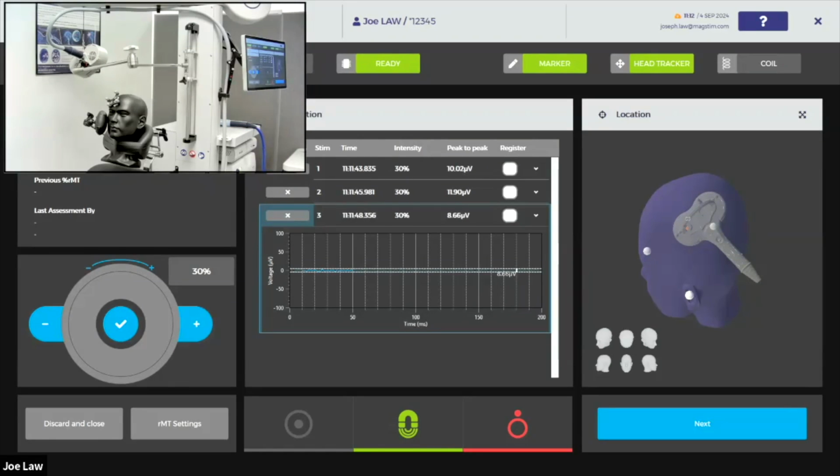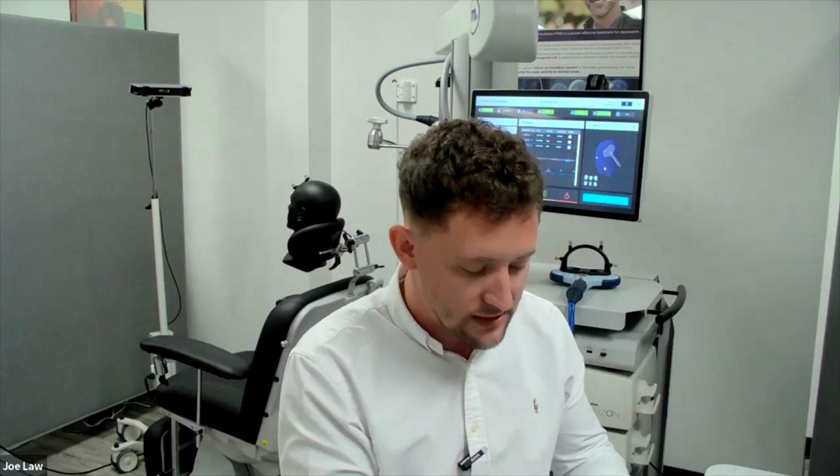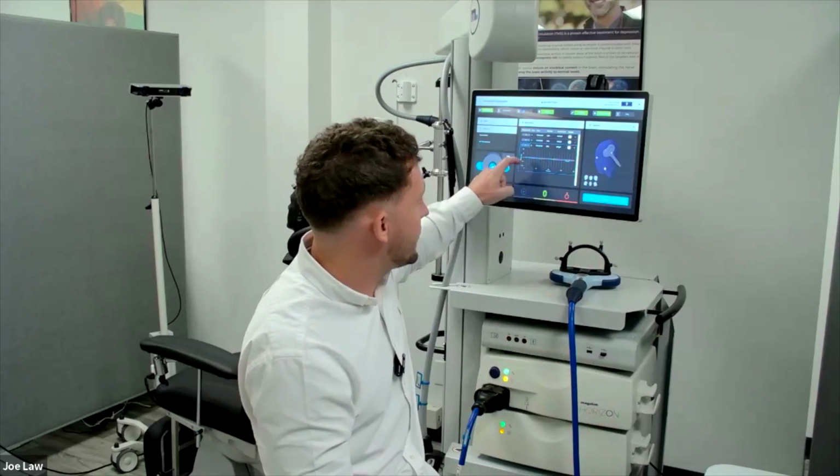So what that allows us to do is look for electric signals from the muscle of what motor response we're looking for. So traditionally, the way TMS is done is when we're doing MDD, we're looking to elicit a response in the patient's thumb, and we would visually look for this. What we can do on this system is plug in some disposable electrodes, EMGs, plug them into the front of the system. You can stick these EMGs to the patient's thumb or whatever motor response you're looking for, and not only will you get a visual response, but you will also then see a nice sine wave on that waveform when you elicit a response and we get muscle signals.